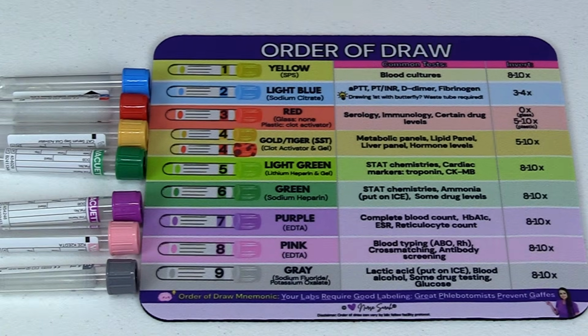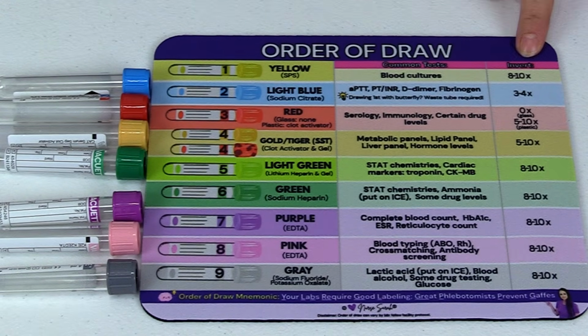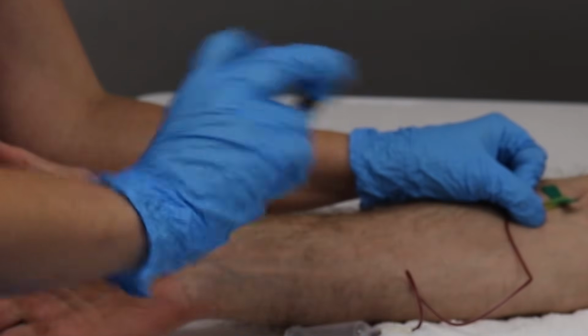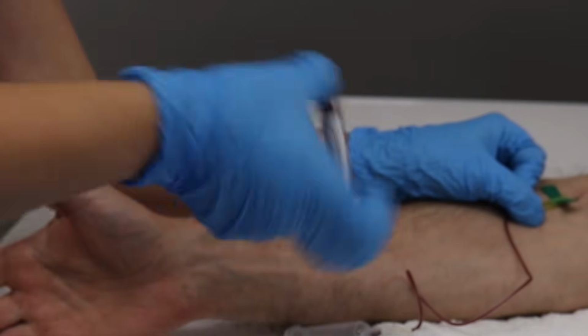So first up will be the yellow tube, also known as our blood cultures. It can come in the yellow tube, but you could also do it in bottles. And it has additive SPS in it. Now with it, you will do an inversion of 8 to 10 times. Now whenever you invert, you will hold the tube like this, your color part's up here, and you will invert it the amount it's supposed to be inverted.